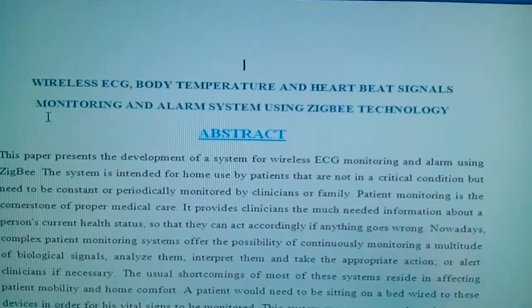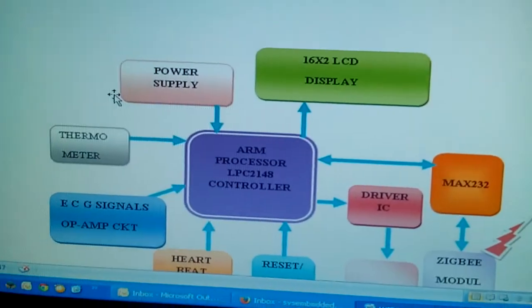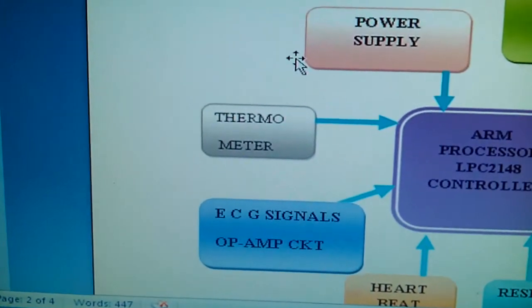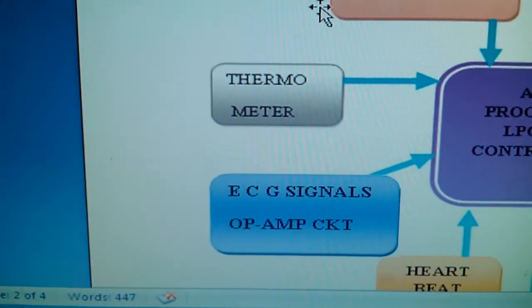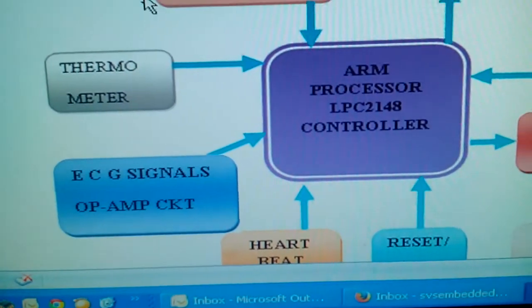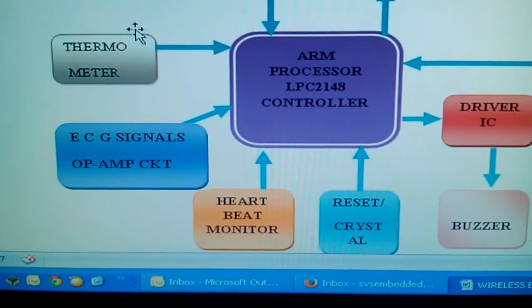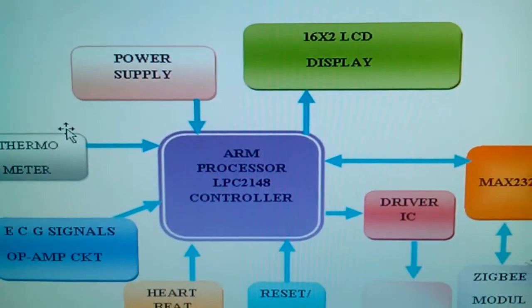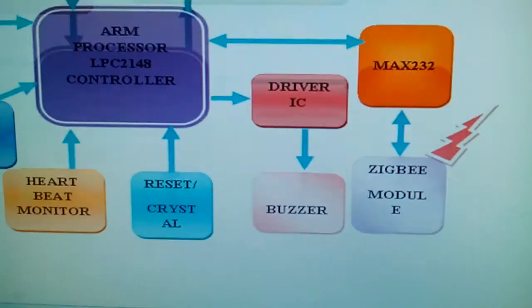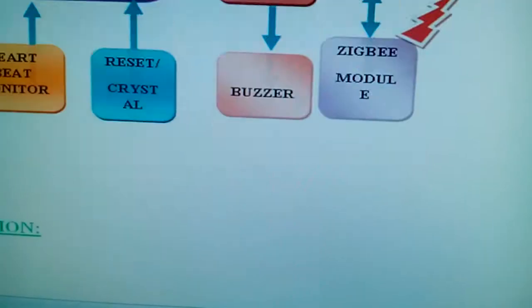In this project, I am using an ARM7 LPC2148 and the LM35 temperature sensor, and I am using ECG signal op-amp circuitry, a heartbeat sensor, and a crystal. The data is displayed on a 16x2 LCD display with alarming, and the data is sent wirelessly using Zigbee Technology.